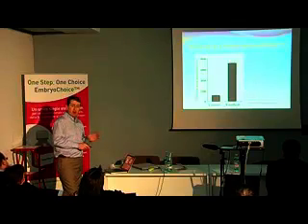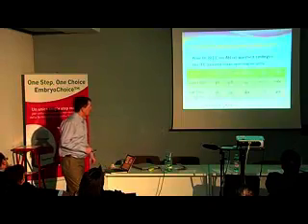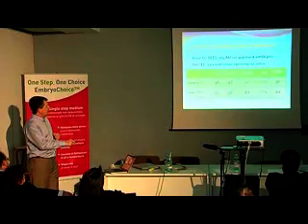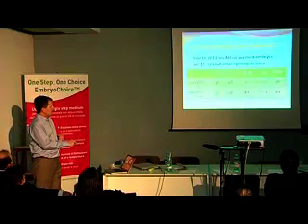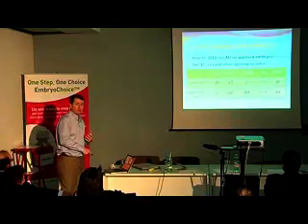So maybe we need to make a hole in the zona, we need to make a cut in the zona so the embryos can get out. So we started doing that in 2011. These are our 2010 data right here. Same age groups as we looked at before. You see the pregnancy rates are doing okay here. After we started making a hole in the shell, allowing the embryos to escape, pregnancy rates pretty much went up across the board. We improved the process across the board for all patients.